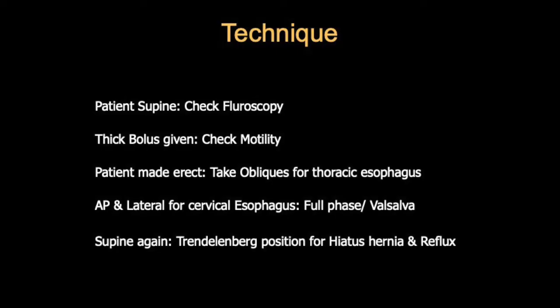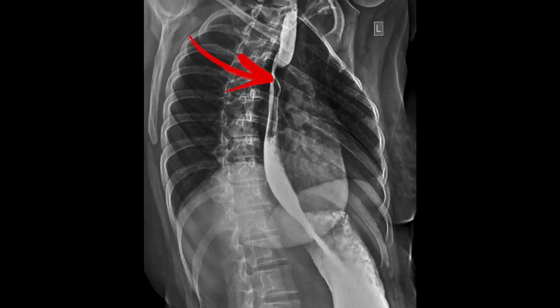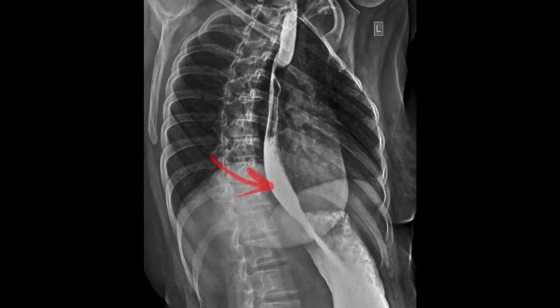We evaluate the valleculae and the piriform fossae, as well as the dorsal and abdominal parts of the esophagus, by giving bolus and taking pictures in oblique positions. We take oblique views so that the barium column moves off the spine — in AP view it would superimpose on the spine. A slight oblique confirmed on fluoroscopy is used, then we give the bolus.